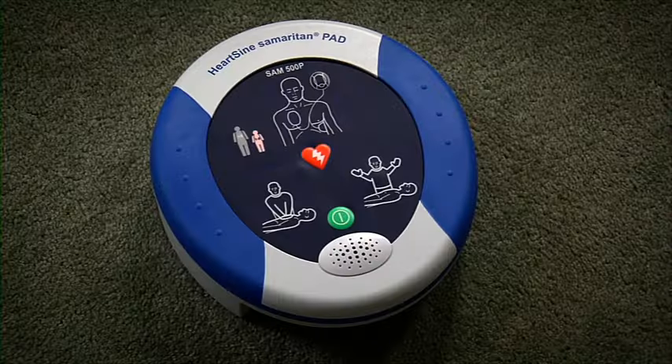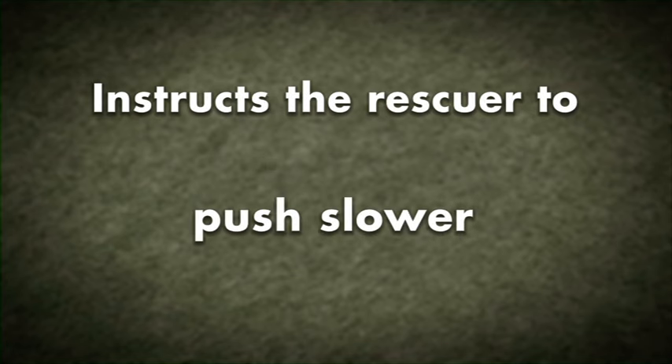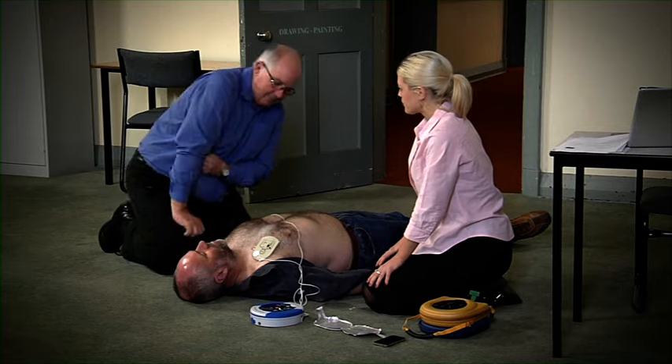Begin CPR. The Samaritan 500P will analyse the effectiveness of the CPR and will instruct the rescuer whether to push harder, push faster or push slower based on real-time feedback. It is safe to touch the patient.